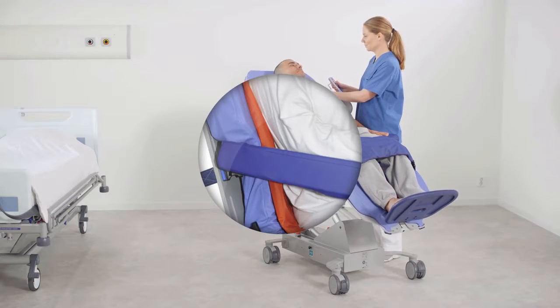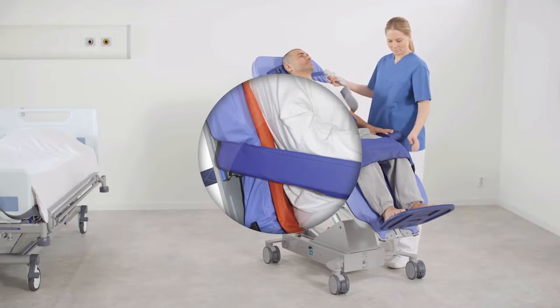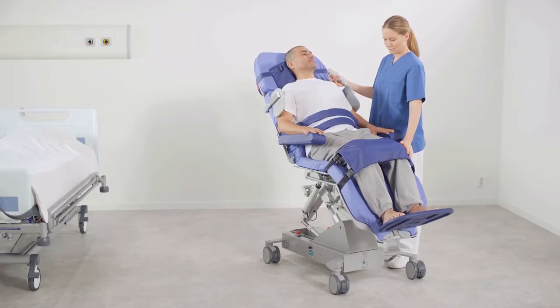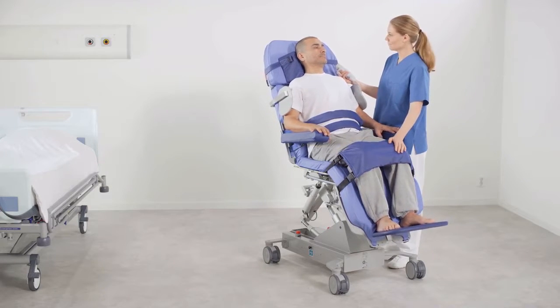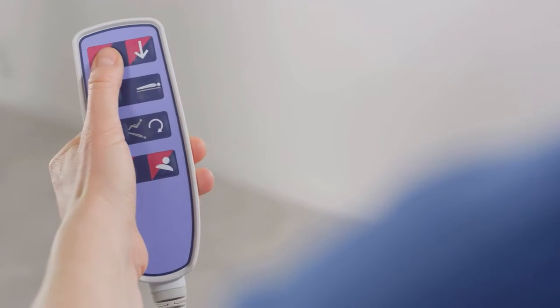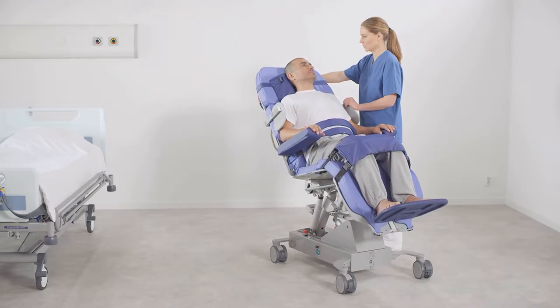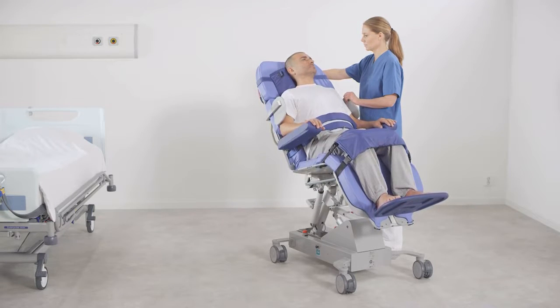A sliding sheet can be used to minimize friction for patients with frail skin. Press the chair button on the hand control to adjust the patient to any comfortable sitting position. Use the up and down buttons to adjust the height. Return the hand control to storage position.